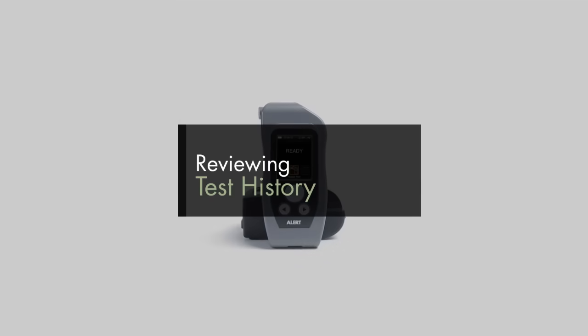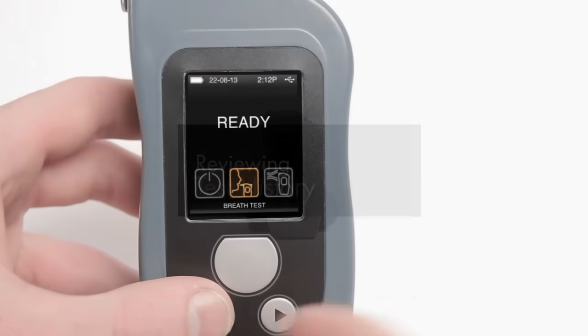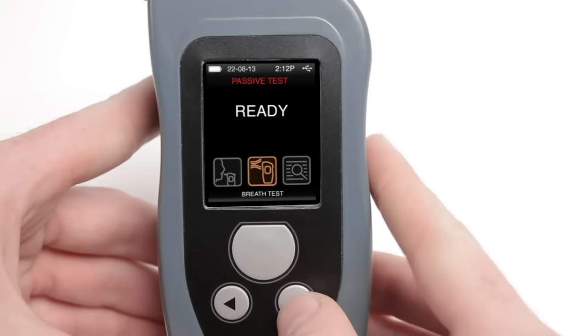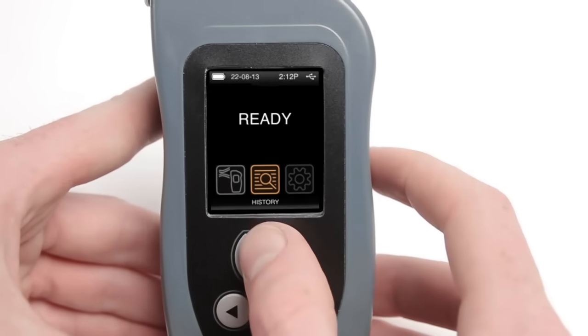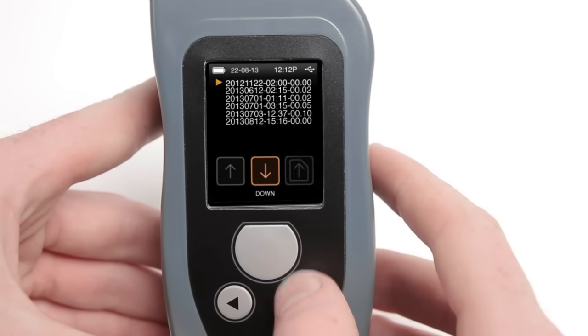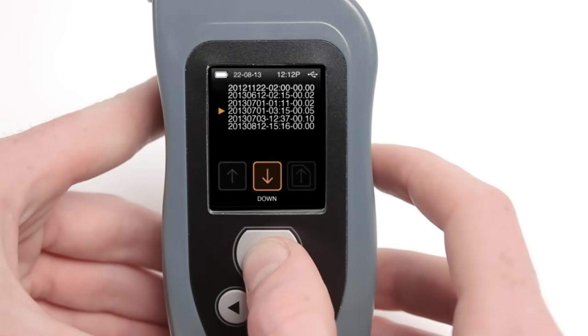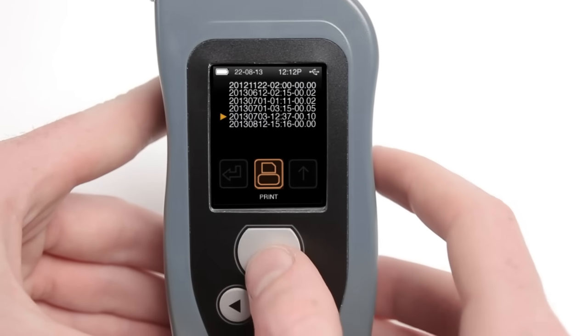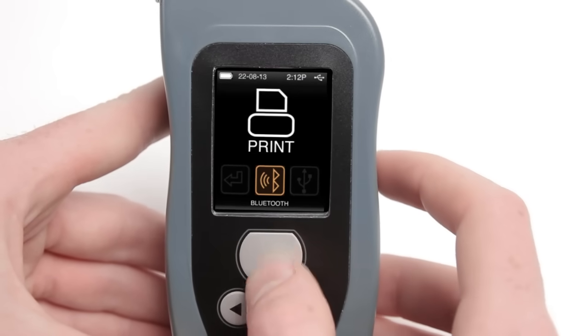Reviewing Test History. Select the history icon from the main menu to review and print the result of past tests. A list with the dates, times, and results of previous tests will appear. Use the buttons to select the scrolling option to move through the list. Print any of the results on the list by selecting the print icon.